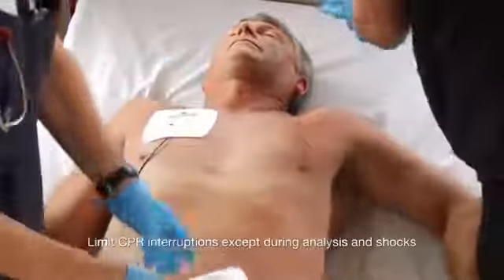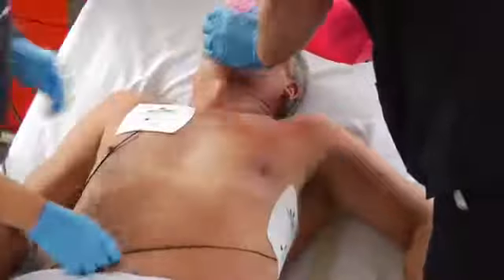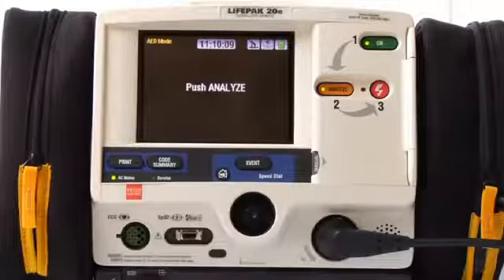Place electrodes away from implanted devices if possible. Be sure the entire electrode surface adheres to the skin. Use fresh electrodes if you have to reapply them. Push Analyze. This message appears and stays up until you push the Analyze button.